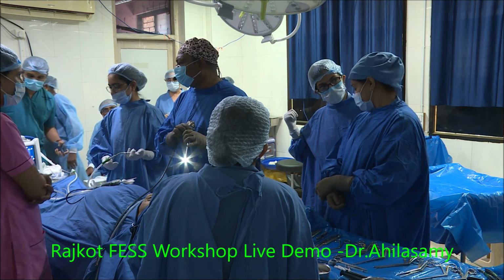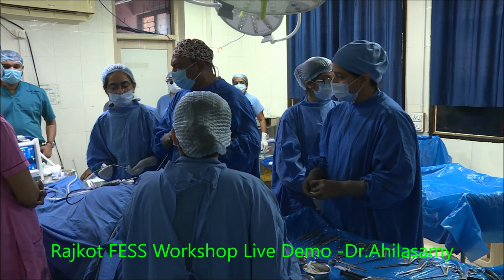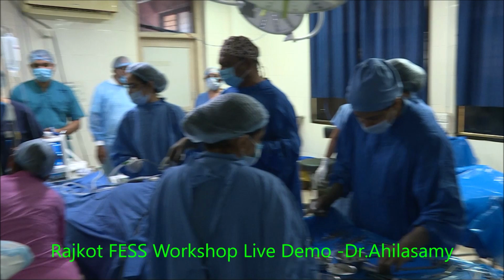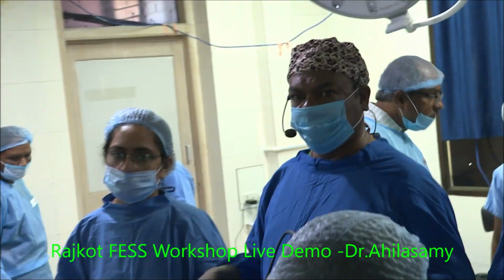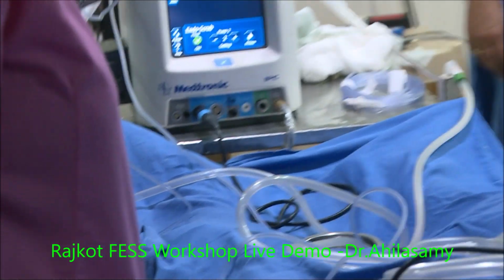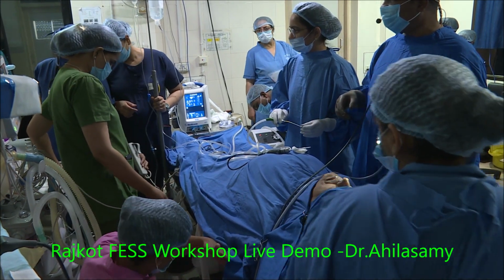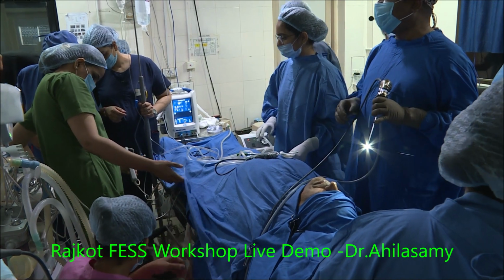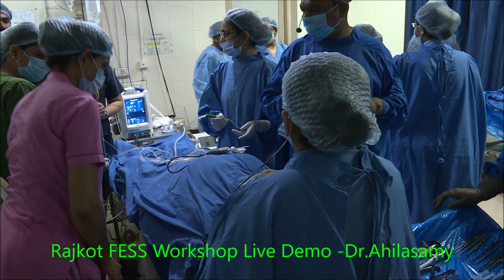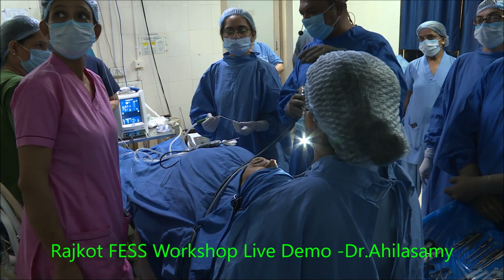Can you adjust the table? Okay, the table is in a neutral position. I am making the head end elevated to 30 degrees. So, the external camera. The table is not going up. So, Tulsi sir, maybe you can continue for some time. Now it's going up. Some more.